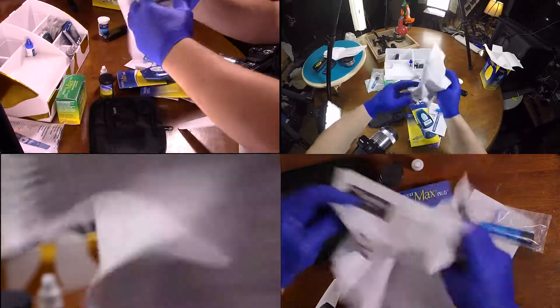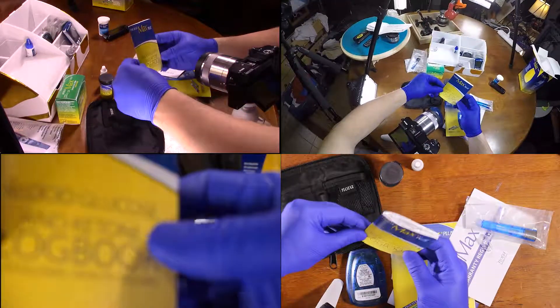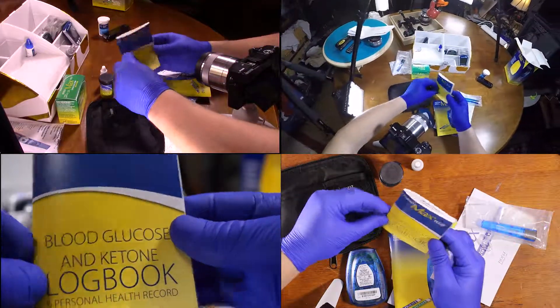This is really good information. We've got this really cool logbook.